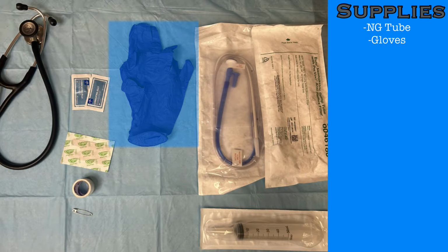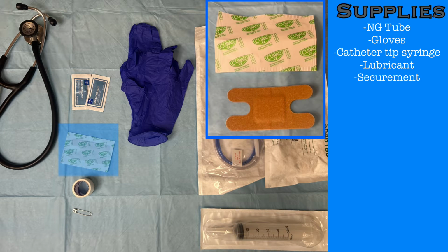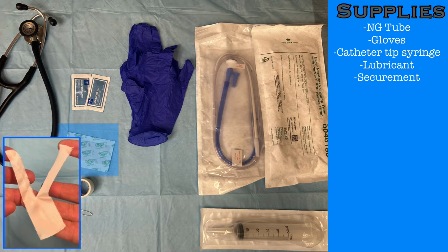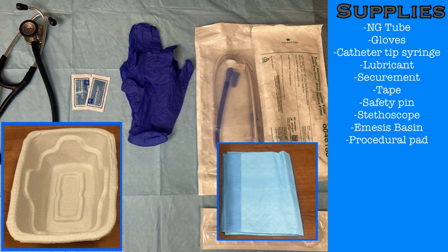You'll also need a pair of gloves, a catheter-tip syringe, lubrication, and something to secure the tube to the patient's nose. At Trinity Livonia, we commonly utilize the H-shaped band-aids, but there are also devices available specifically designed for securing NG tubes, or you can use the split tape method. You'll also need some tape, a safety pin, a stethoscope, an emesis basin, and a procedural pad.